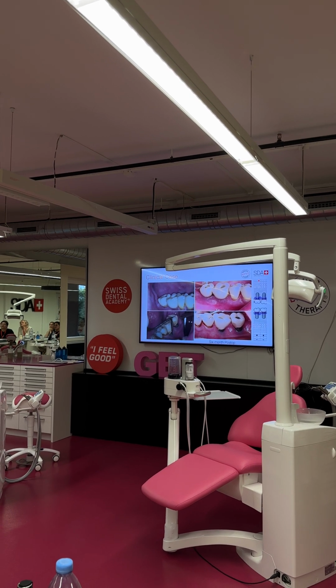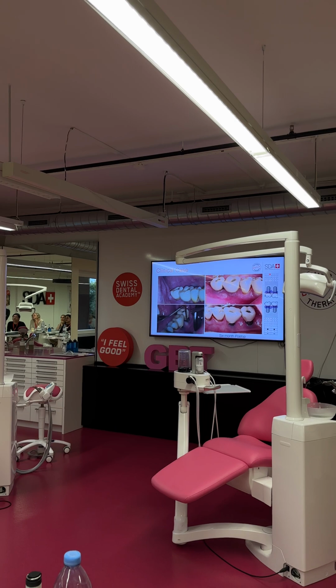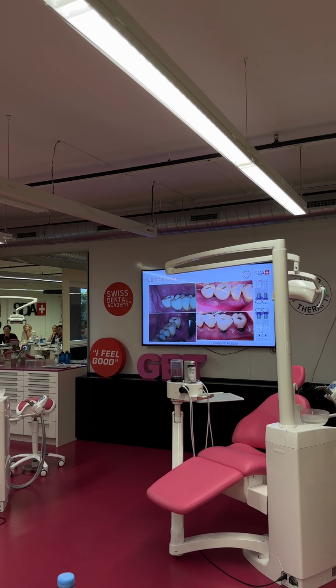the inflammation is also greatly controlled, I would say. Yeah, the soft tissue looks great. Yeah. It's 6 months. How often do you put the patients? Every 3 months, every 3 at least, yeah.